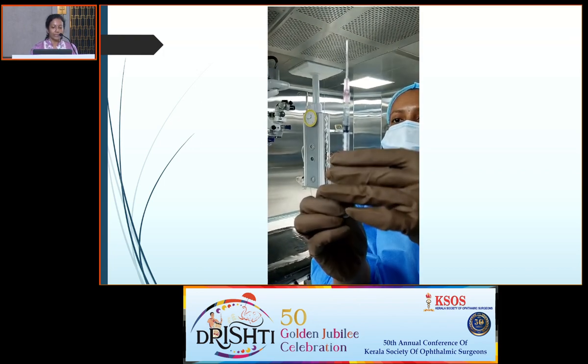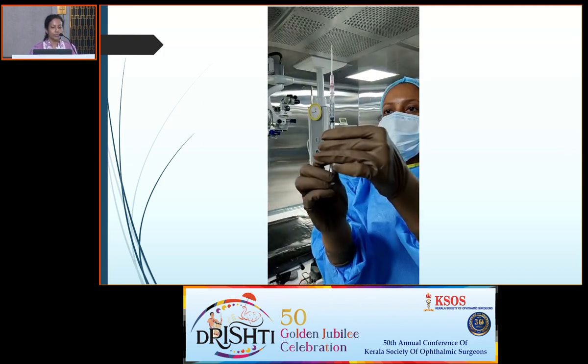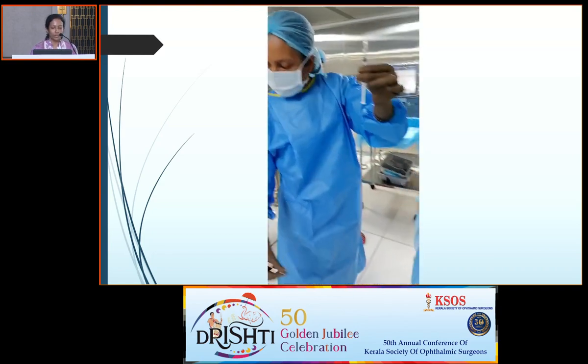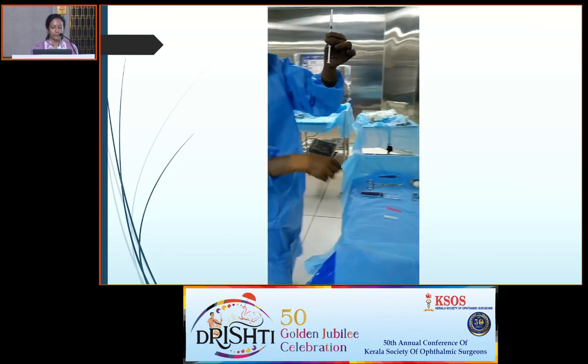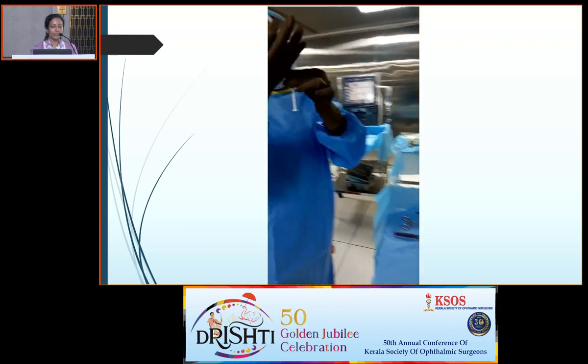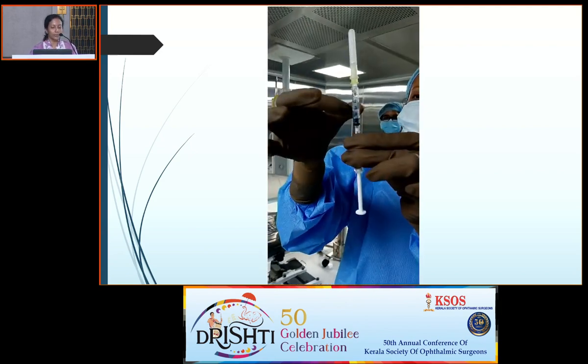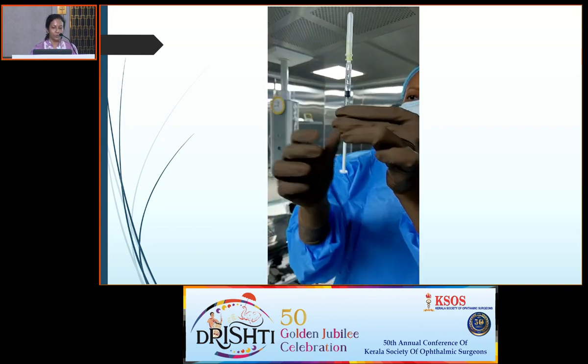And at this point, I slightly withdraw the piston a little more so that whatever injection is there in the filter needle also comes into the syringe. Now dispose of the filter needle and you place the 30 gauge syringe. I hold the syringe at my eye level so that I do not mistake air columns and fluid columns.